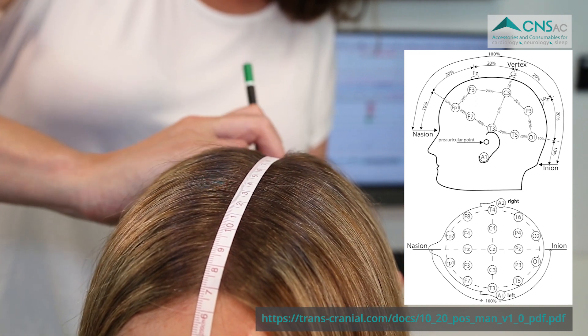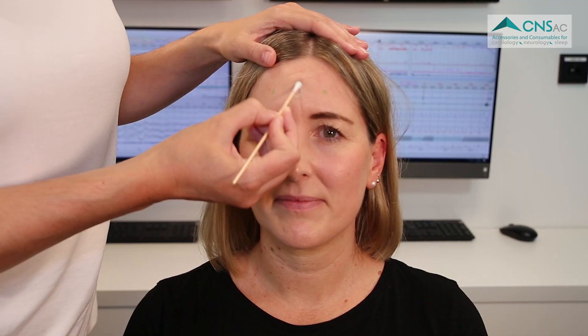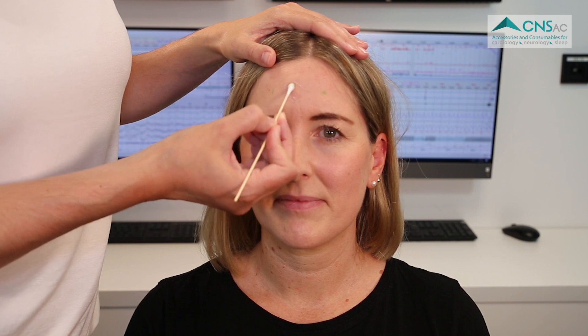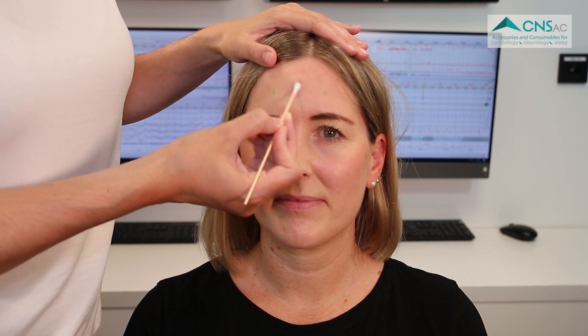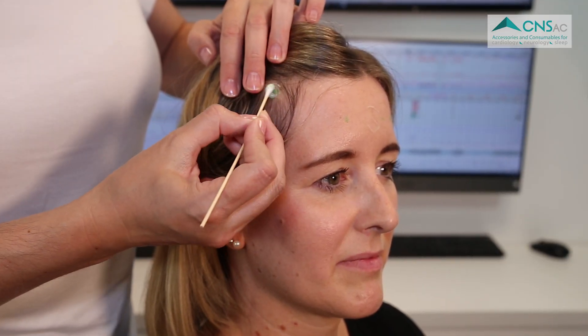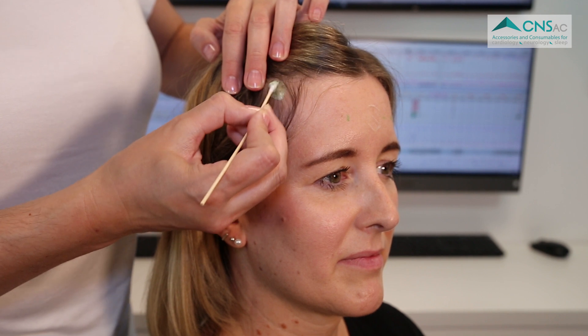After you have marked all the EEG electrode points according to the International 10-20 system, each point should be prepped using an abrasive gel on a cotton swab in order to ensure better electrical contact for the electrodes, which is also called impedance. Take a small amount of the abrasive gel and rub the skin gently.